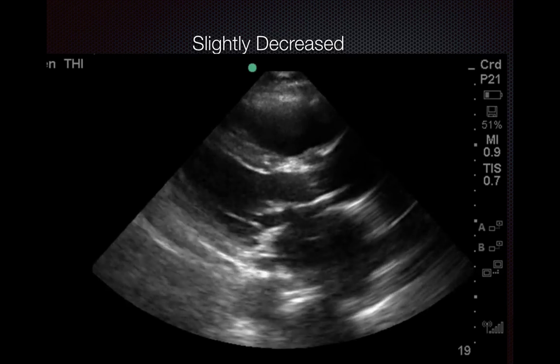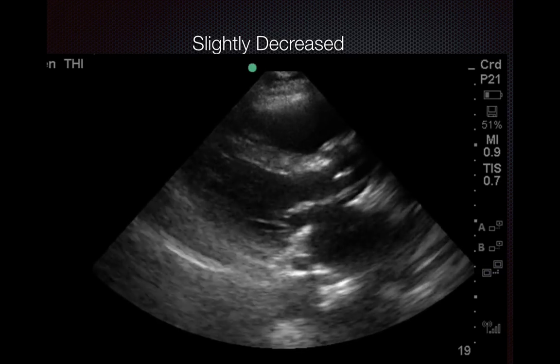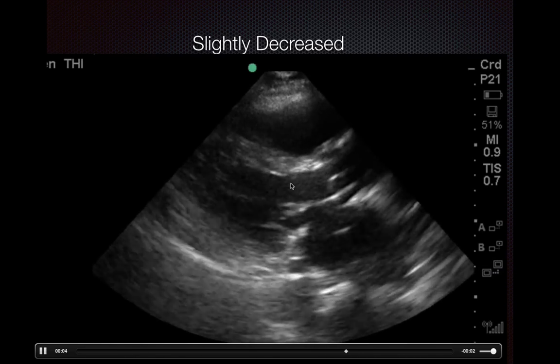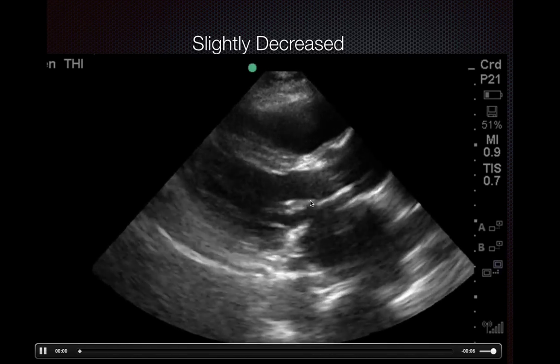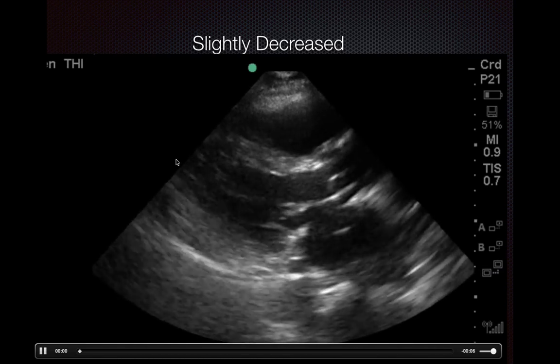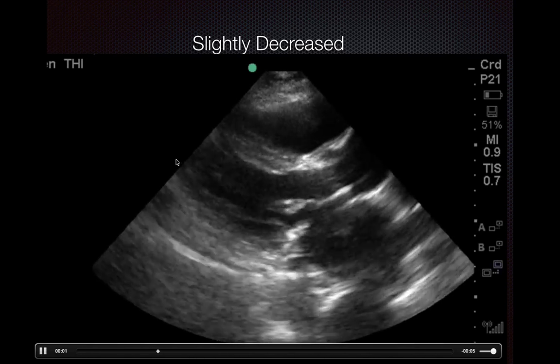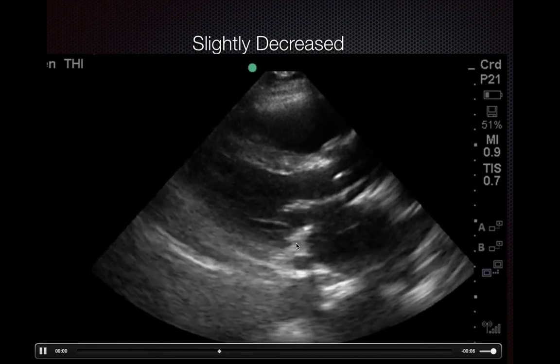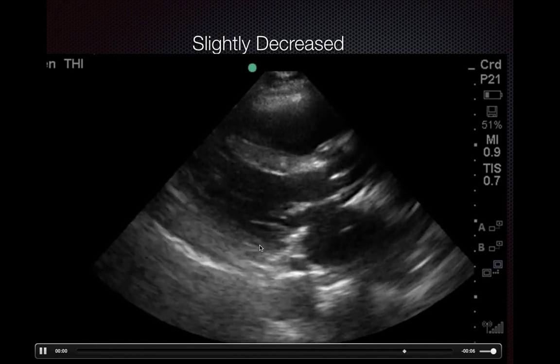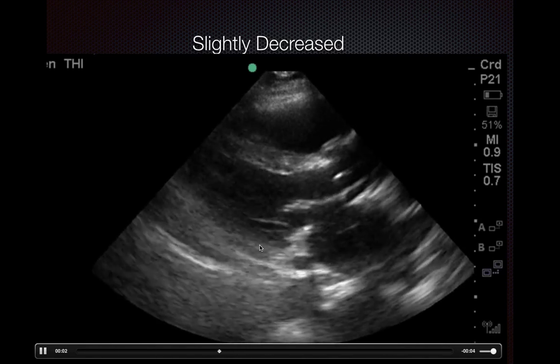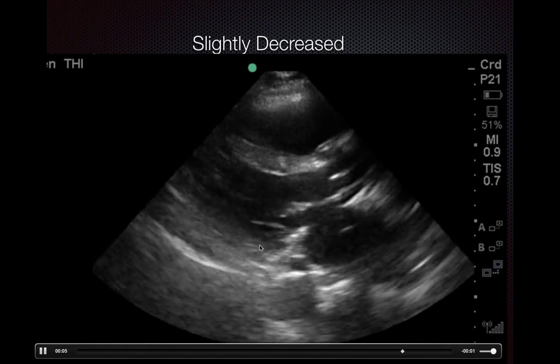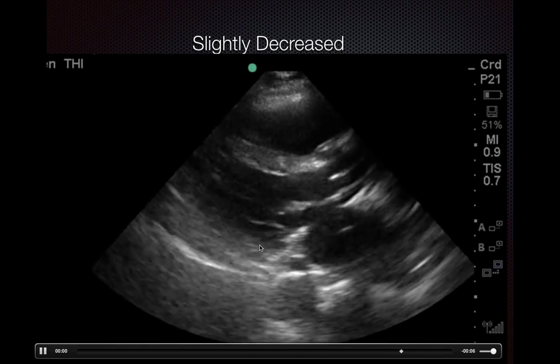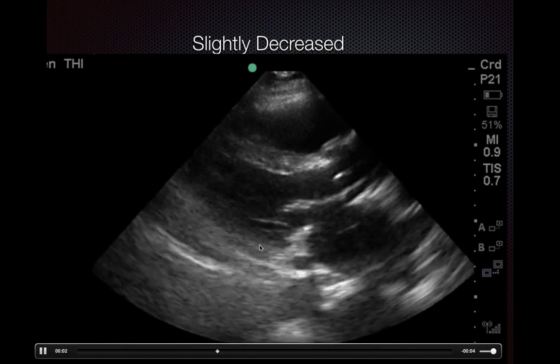This is an example of a heart with slightly decreased ejection fraction. You can see that this part of the left ventricular wall is contracting okay, but the septum isn't moving very well, and the anterior leaflet of the mitral valve isn't quite hitting that septum. We would call this a slightly decreased EF. And if you were fluid resuscitating this person, you would also note that this valve leaflet is really thick and not moving very well at all, which raises awareness that this may be someone who has trouble with quick boluses of fluid — so you want to be on alert for pulmonary edema.